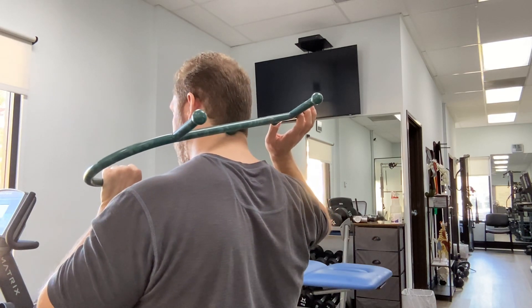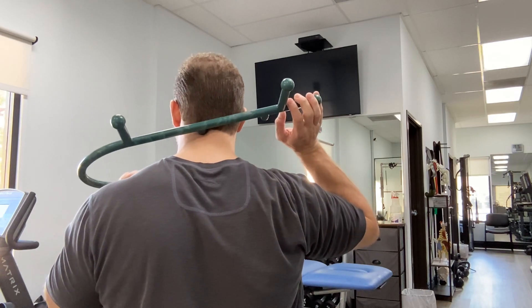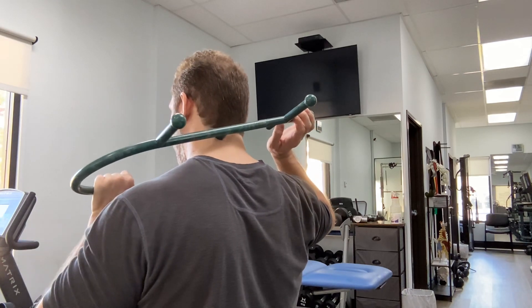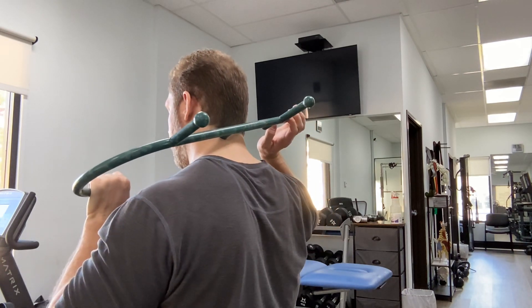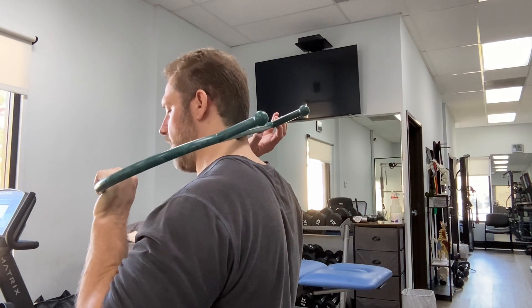I'm doing this pretty gently because this is, at least for me, a more tender area. You can move the Theracane up or down depending on your tenderness. A minute or two is all you need to spend doing the whole area.